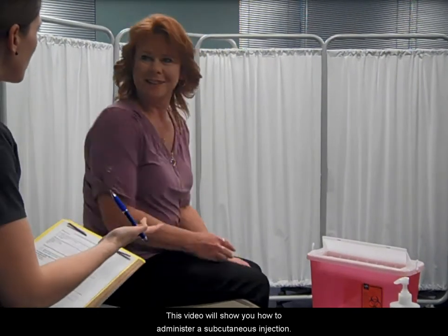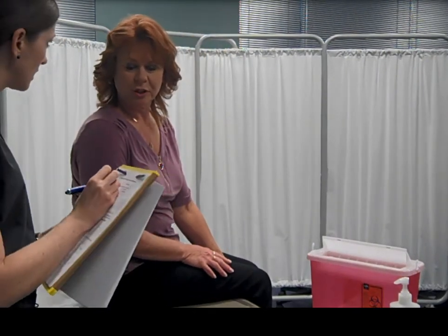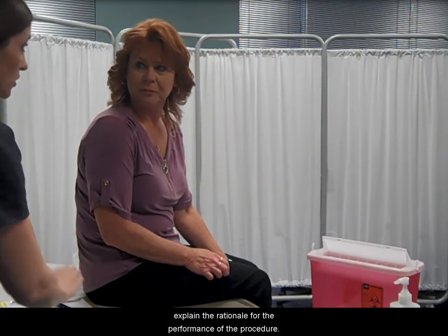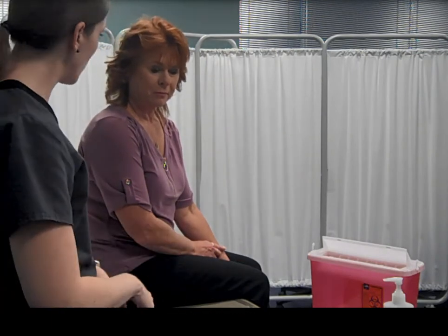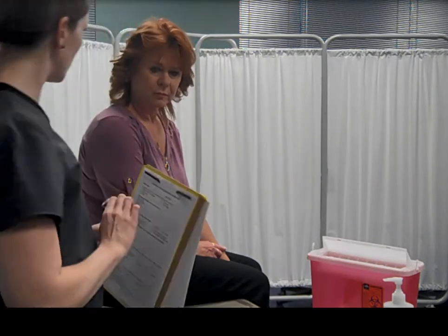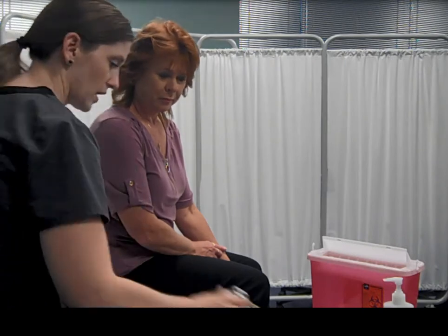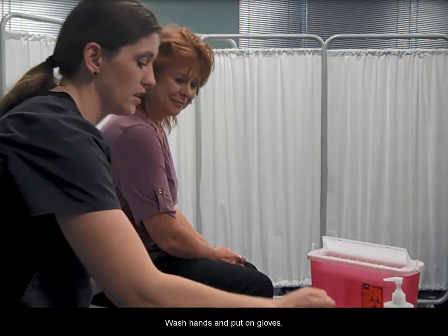This video will show you how to administer a subcutaneous injection. Introduce yourself and identify the patient, and explain the rationale for the performance of the procedure. Verify the medication order. Wash hands and put on gloves.